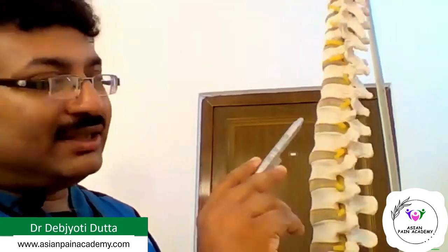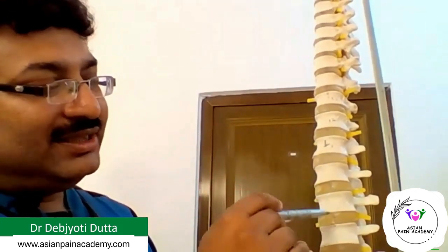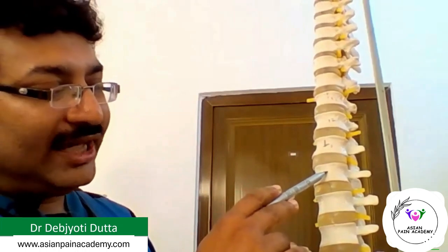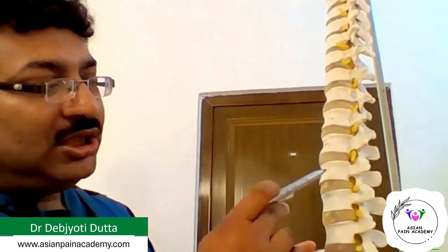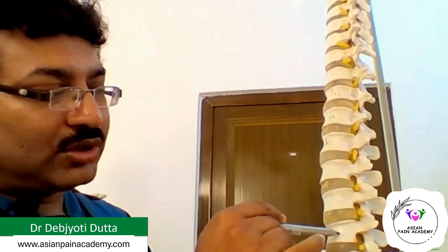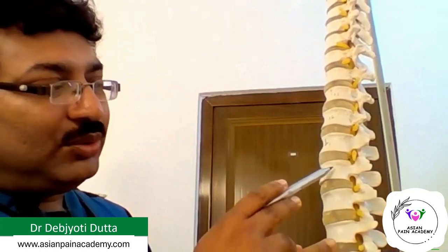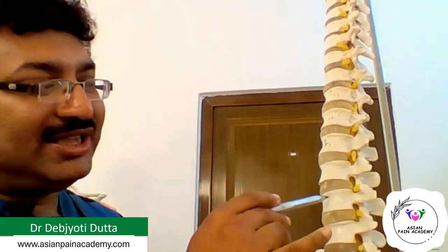Now, this is the L1 vertebra. The lumbar sympathetic chain is usually blocked at the level of L2, L3 and L4. Now, as I have told, the chain is coming through the anterolateral corner of the vertebrae. The ganglia are situated closer to the L2-3 disc.